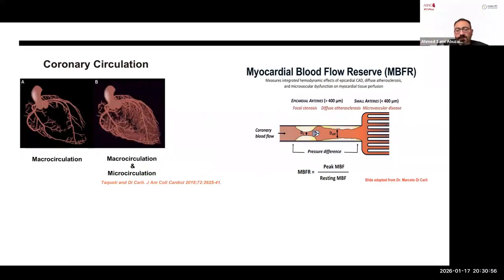So depending on your software, the number is going to come to you. All really modern software can give you myocardial blood flow data and give you maps and all of these things. Basically we measure the blood flow at peak and rest, and we divide them, and we have a reserve.